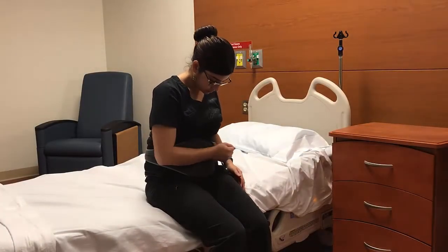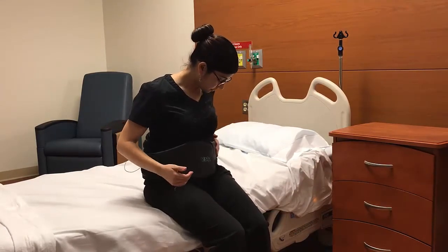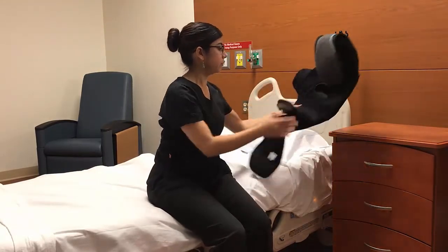To take off your LSO, simply detach the adjustment straps, fasten them to the sides, open the brace, and place it next to your bed.